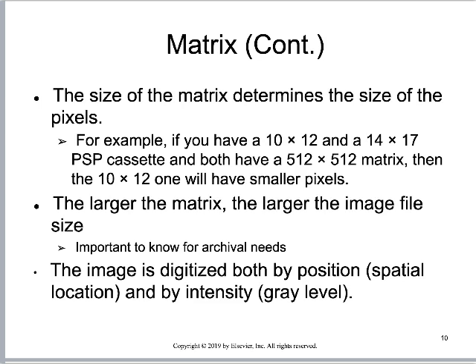Good question. So, again, to repeat, reducing your field of view, coning in, reduces patient dose, improves image contrast, and shrinks our pixels, so it gives us better spatial resolution. The big reason for all of this is that the image is going to be digitized. I'll say it one more time.